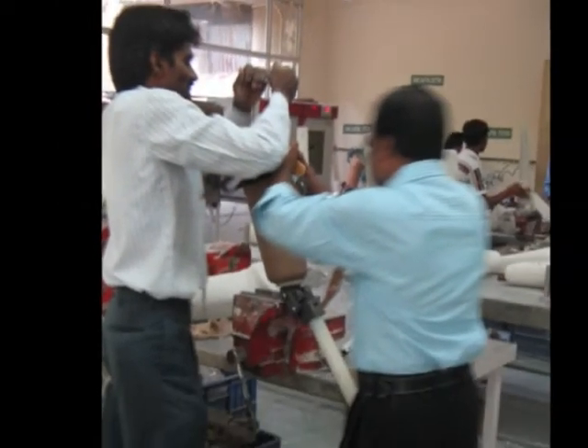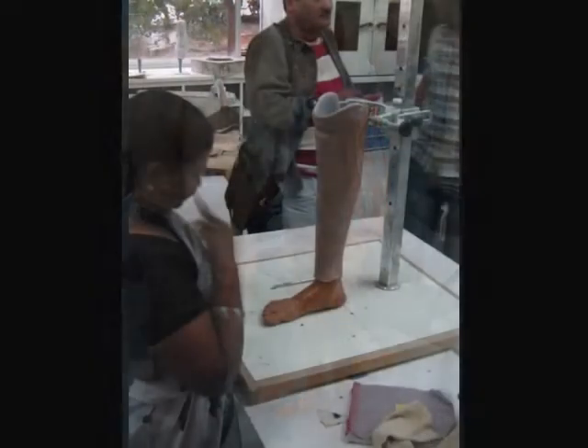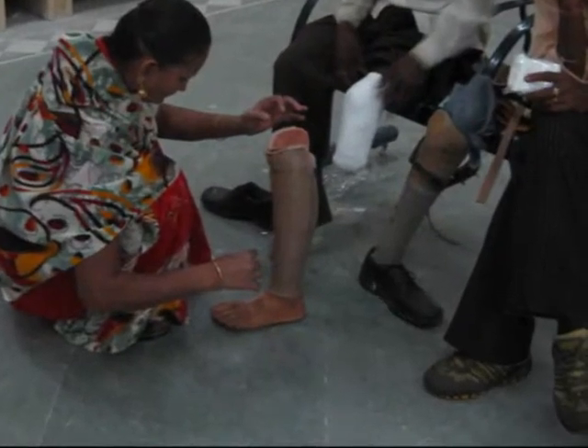I saw the fabrication process first hand, closely analysing every step. In the end, we've managed to narrow down the focus of the assignment to a very important issue concerning their most used product, the below-the-knee prosthesis.